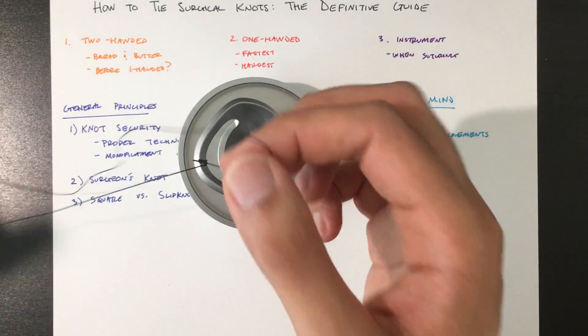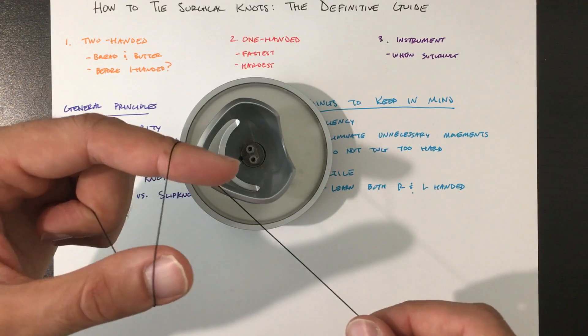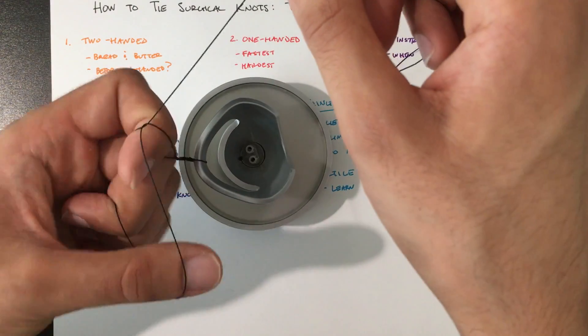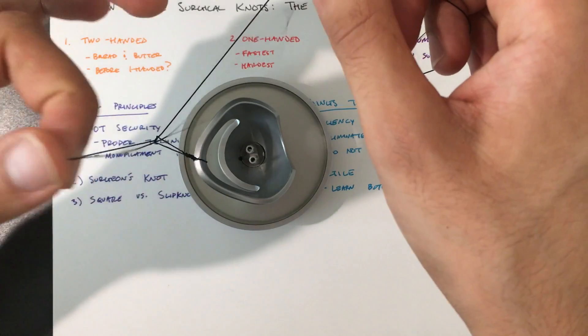I'm going to show you that one more time. So you have the gun. Opposite direction. Wrap around. Pull it through.